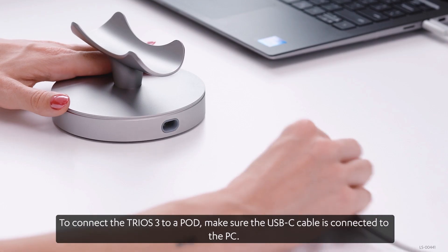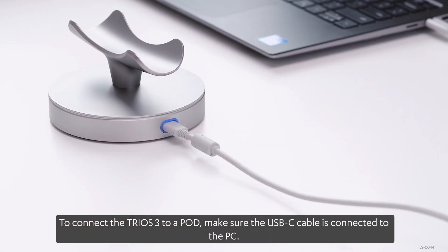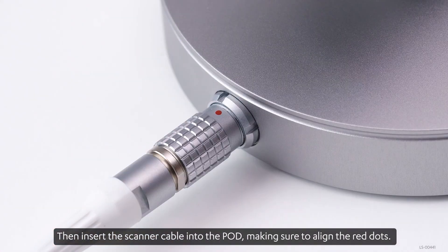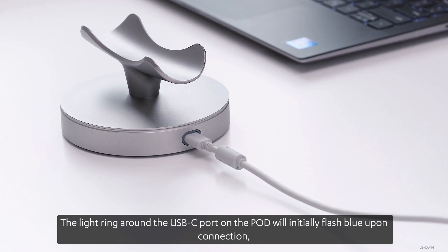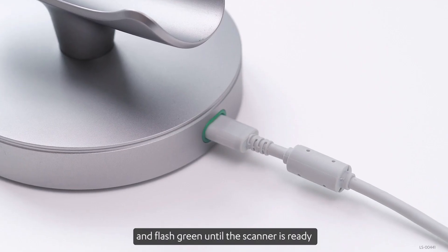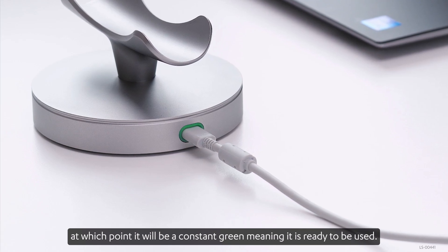To connect the Trios 3 to a pod, make sure the USB-C cable is connected to the PC. Then insert the scanner cable into the pod, making sure to align the red dots. The light ring around the USB-C port on the pod will initially flash blue upon connection and flash green until the scanner is ready, at which point it will be a constant green, meaning it is ready to be used.